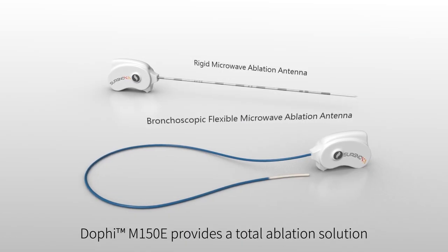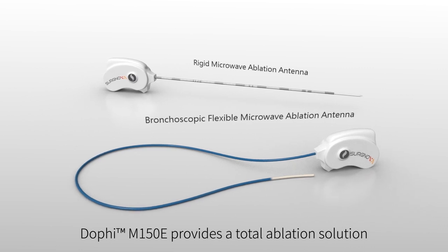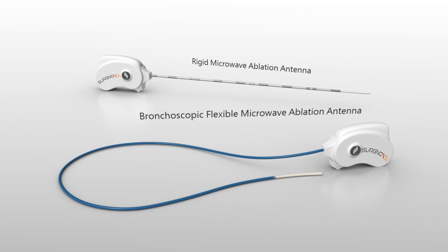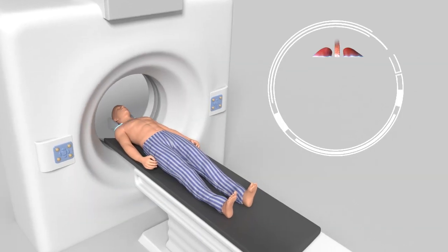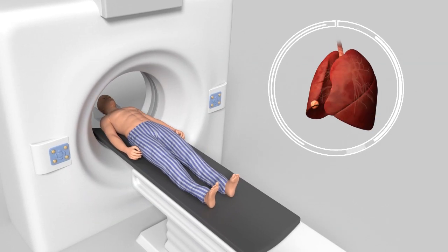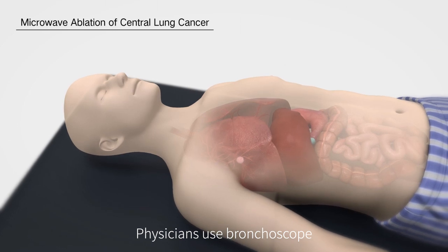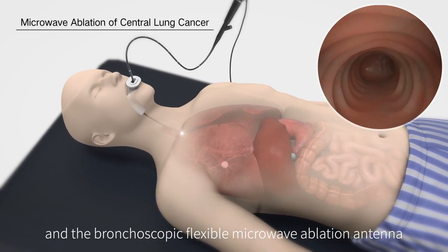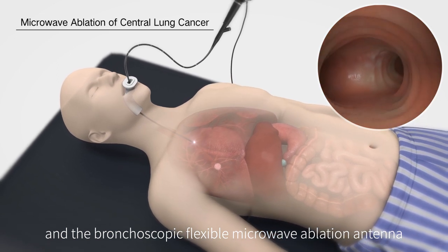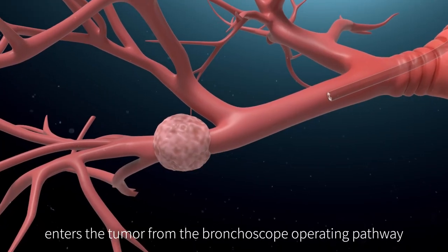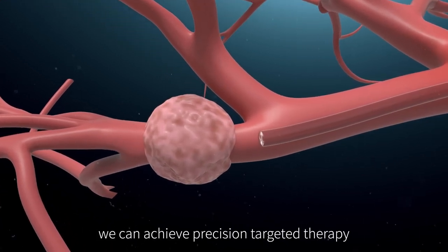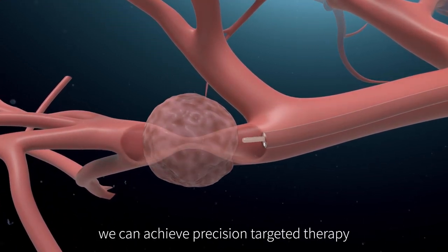Dophi M150E provides a total ablation solution for central lung cancer and peripheral lung cancer treatment. Physicians use bronchoscope to determine the exact location of the tumor, and the bronchoscopic flexible microwave ablation antenna enters the tumor from the bronchoscope operating pathway. In this way, we can achieve precision-targeted therapy.